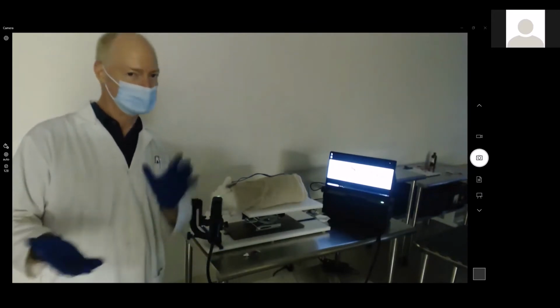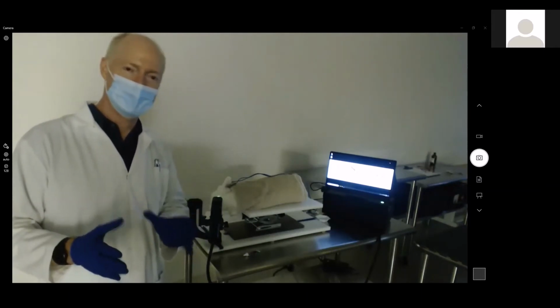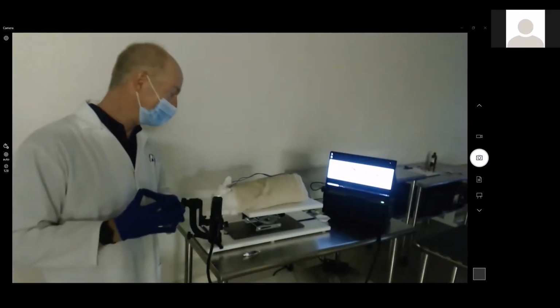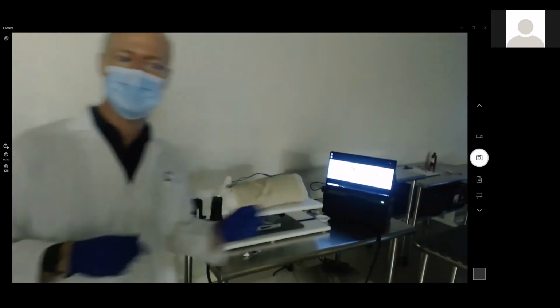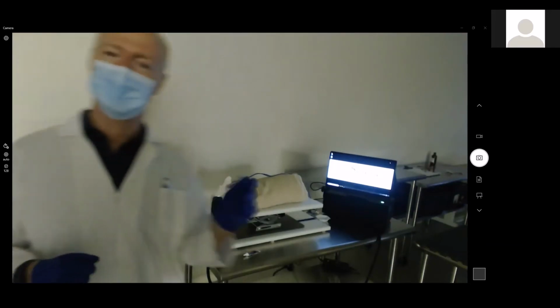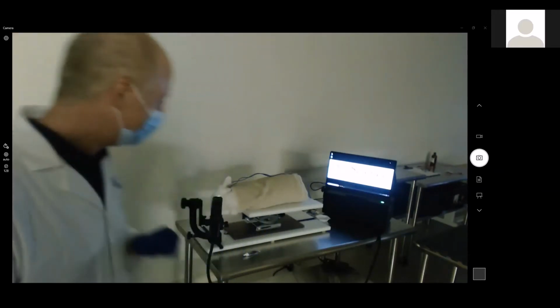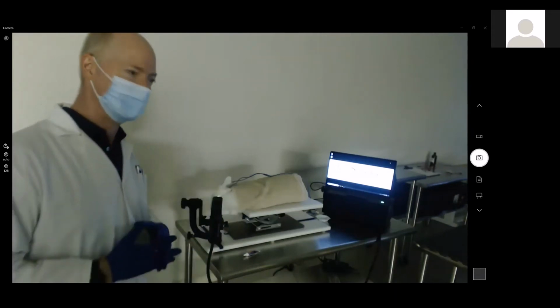It's of course like any animal: the more compliant they are, the easier it is to collect data. Working with a puppy could be a bit challenging, so wish me luck in that regard. We're going to make a real quick change here. Then lastly, I'm going to do a fundus image using a different technology, just a little fundus camera, so that people get a quick appreciation for what that can do as well. That's pretty much it, and then we'll conclude this wet lab after that.